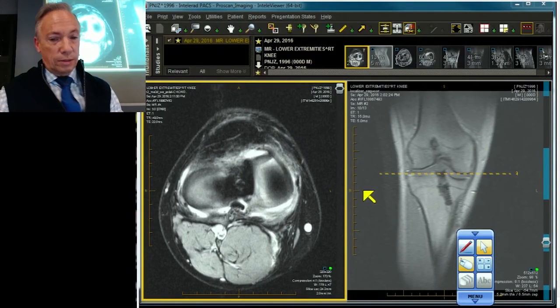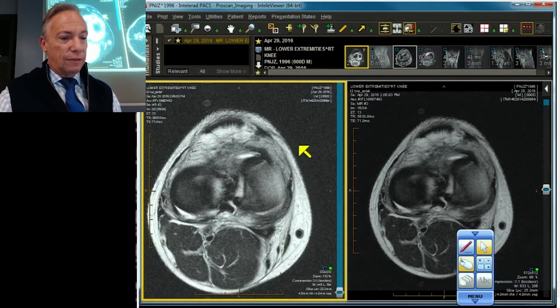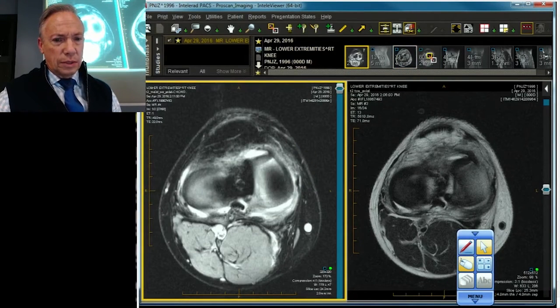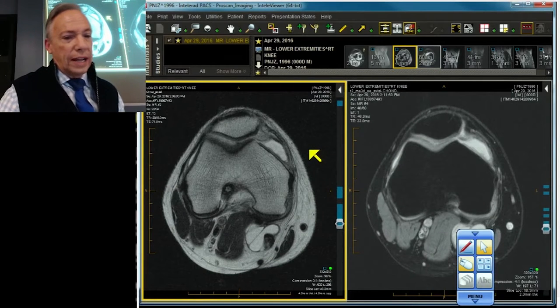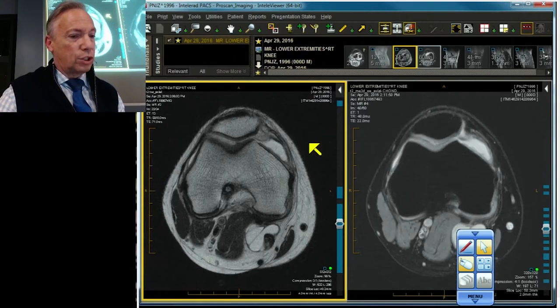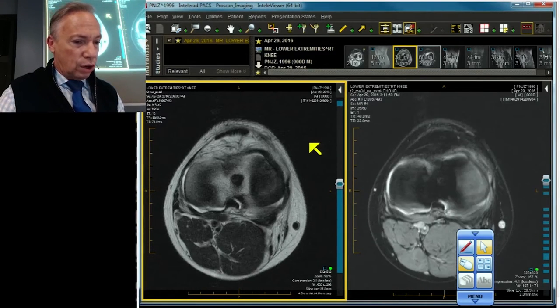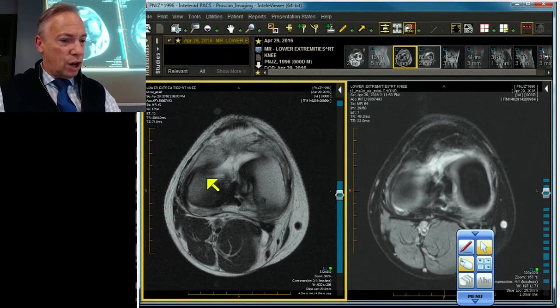Let's take a case. Here are two axial images — the one on your left is a T2, and the one on your right is a fat-suppressed 3D. We're going to work our way down to the meniscal level. We start up high, go down low, and we see a rather bizarre-looking configuration.